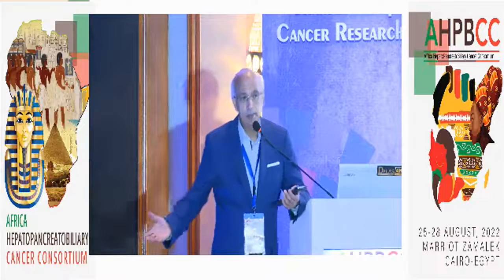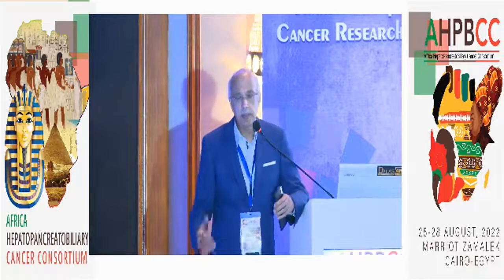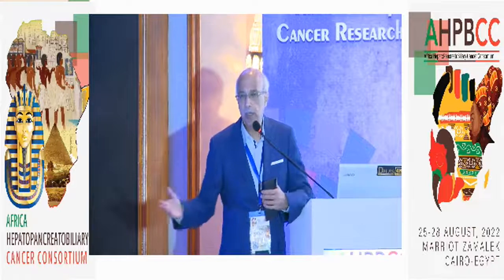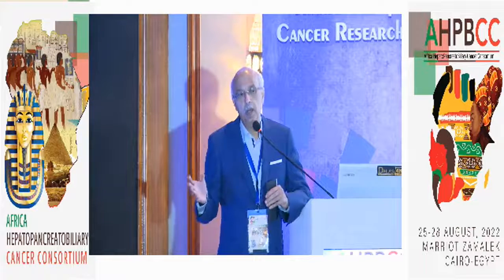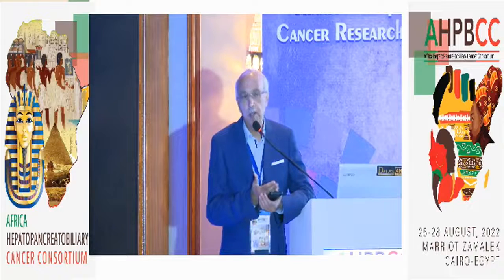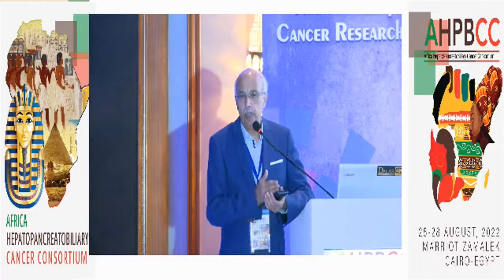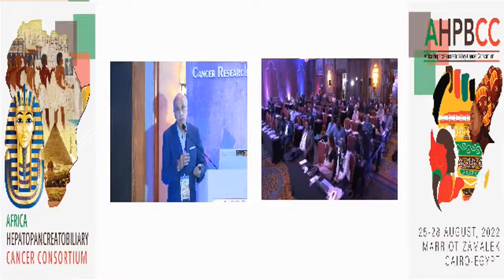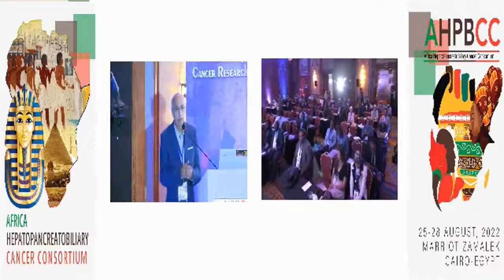The new advanced machines, including the Doppler, the dynamic Doppler, and the use of contrast media with the ultrasound, are changing the equation of the diagnosis of liver disease in general and hepatic focal lesions, particularly hepatocellular carcinoma. I hope this workshop was an introduction to the value of the ultrasound.